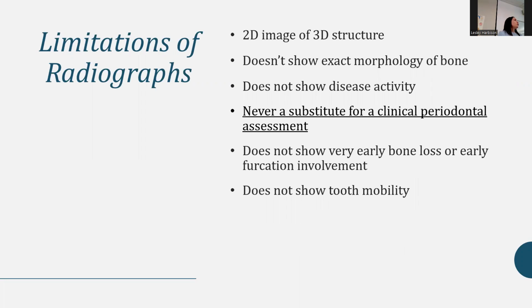Similar with perio, one clinician will look at something and interpret it one way, and another will interpret it slightly differently, because we're talking about percentages that we think it looks like off of a radiograph. So it's not black and white, and everybody tends to have their own style, either very aggressive at treatment planning or more laid back. So just take that with a grain of salt. There's no hard black and white. There are general camps though that we'll live in, and you do need to know those for sure.